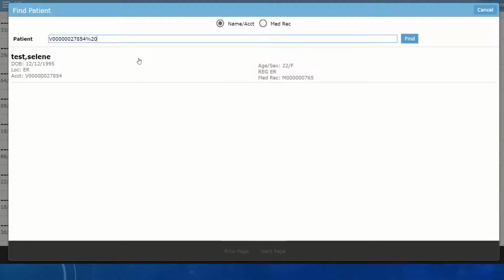It is important that you do all of these steps at the bedside because now we are going to be training staff that we are going to be printing our labels at the bedside. It's for a safety reason, and we should be scanning at the bedside. It might be a good idea to have a little cart with you of what you need for blood draws because you don't want to be running in and out of the room.